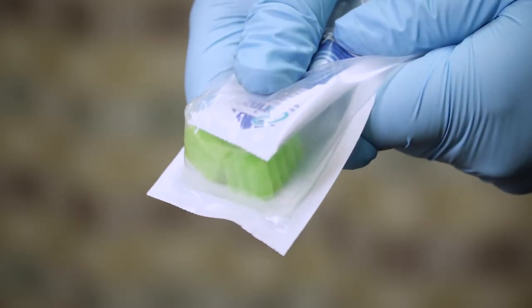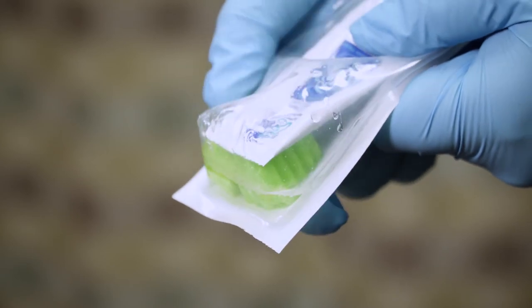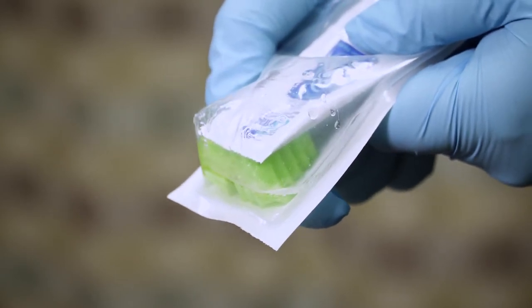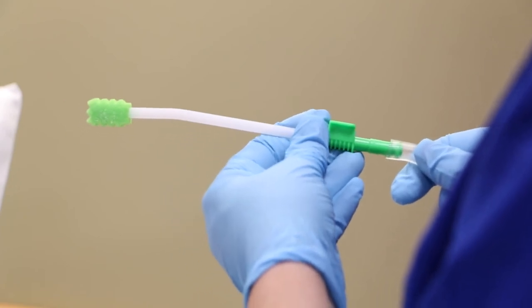Before opening, use your thumbs to burst the solution packet. This releases the oral solution and saturates the swab. Peel the lid to open the package, remove the suction swab, and attach it to the suction tubing.